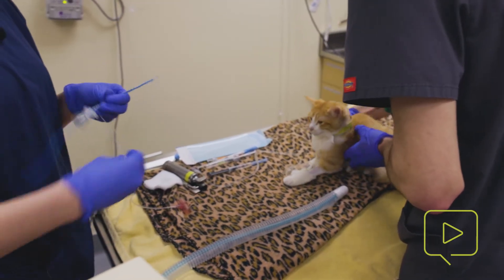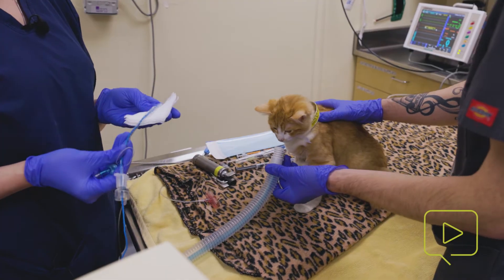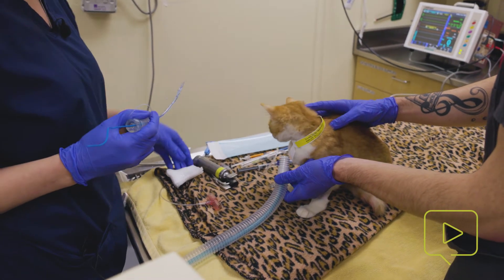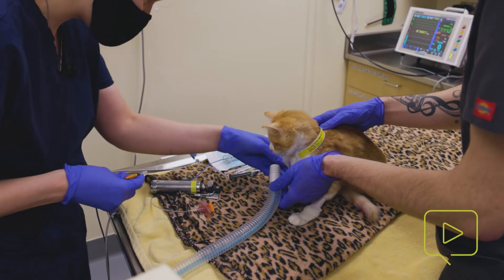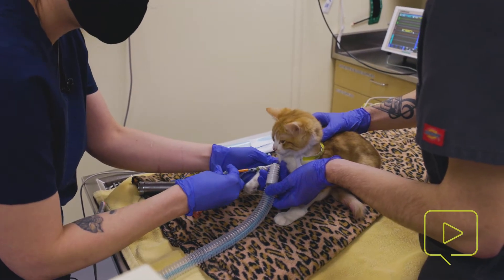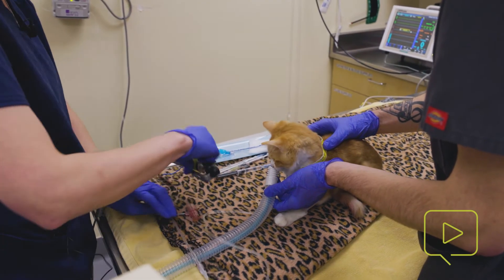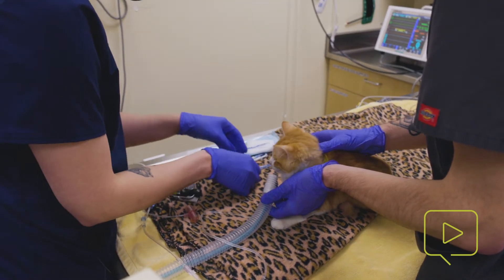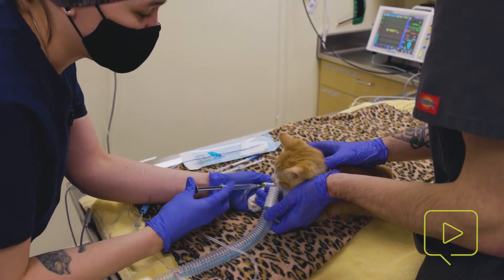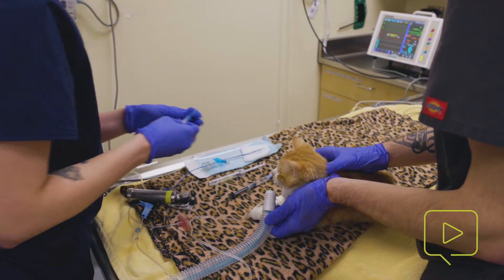So we'll go ahead and get started. We've already leak checked our anesthetic machine, done the safety check, and we have an emergency drug sheet — that way, if we do have an emergency during the placement, we're ready with all the information we need to do any rescue procedures. It's important to lubricate the end of your ET tube — one, for the smoothness of the placement, and also the lubricant can act as a seal for any little spaces in the cuff when we inflate it. Even for ET tubes that do not have a cuff, it's still important to do a little bit of sterile lubrication on the end for that ease of placement.